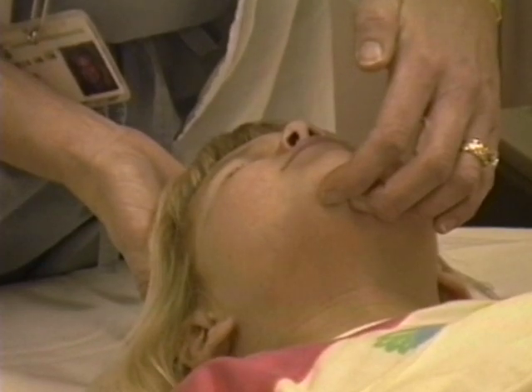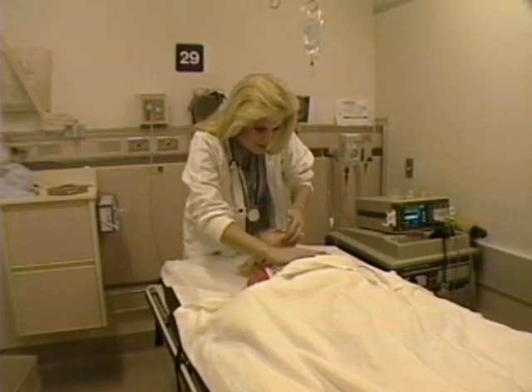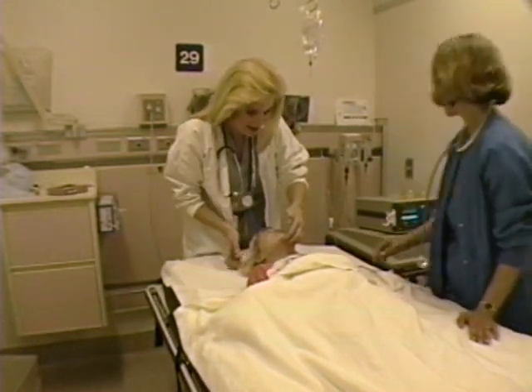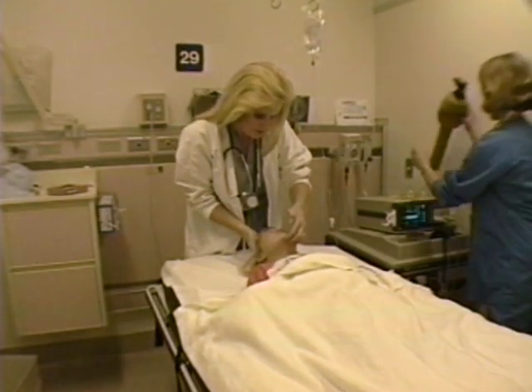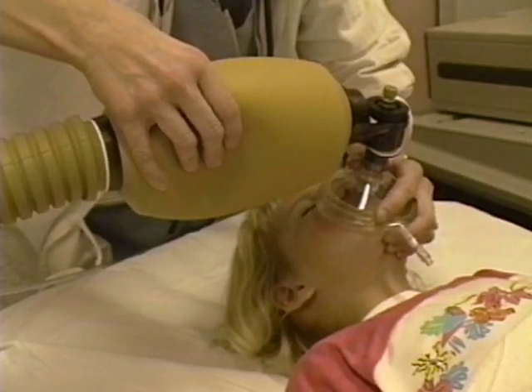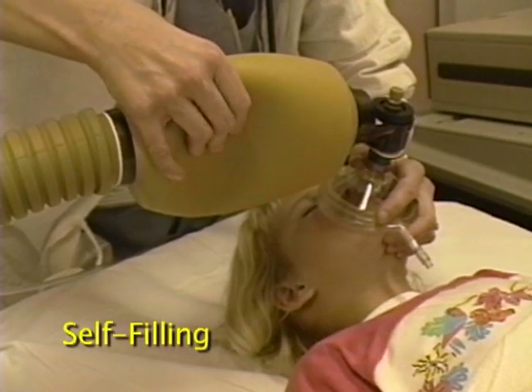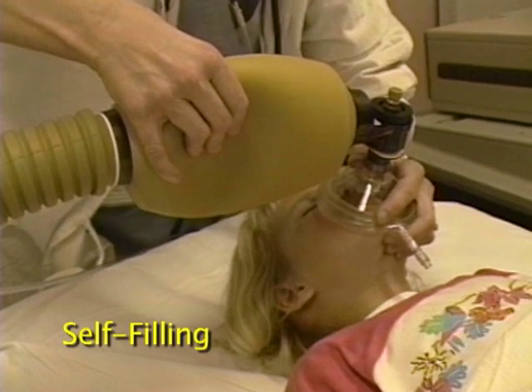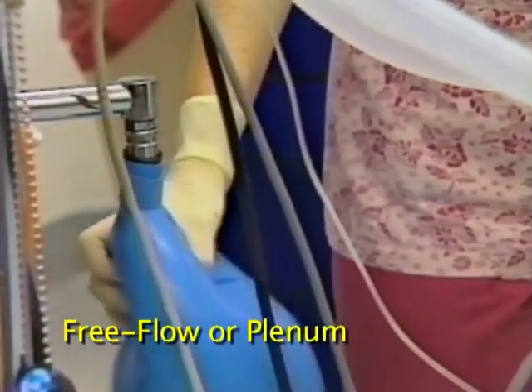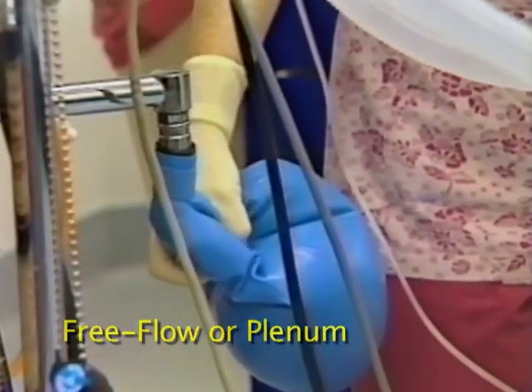After opening the airway, check your patient's ventilation. If the patient still isn't breathing well, you should immediately assist or control the respiration. Mouth-to-mouth ventilation is one option. Here, we'll discuss the use of a bag valve mask apparatus. There are different types of bag valve mask devices. Here, you'll see ventilation with either the typical self-filling resuscitation bag, like an ambu bag, or with a free flow or plenum-style anesthesia machine circuit demonstrated.